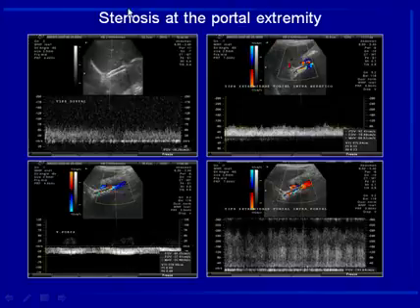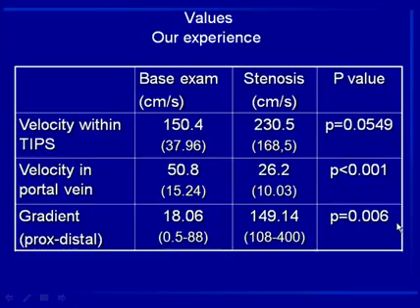This is a case of stenosis at the portal extremity, where I can identify a high velocity in the portal extremity, close to 300 centimeters per second.